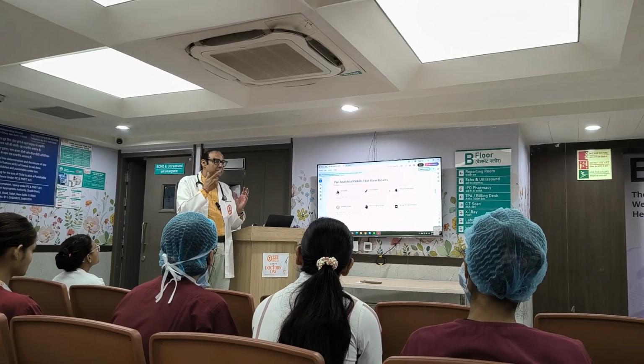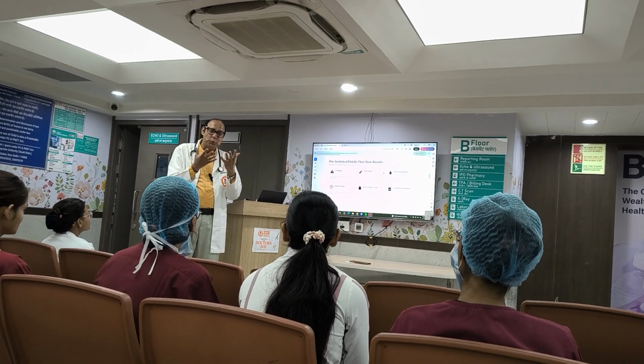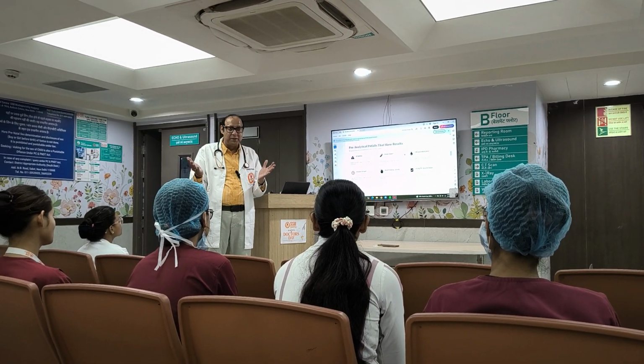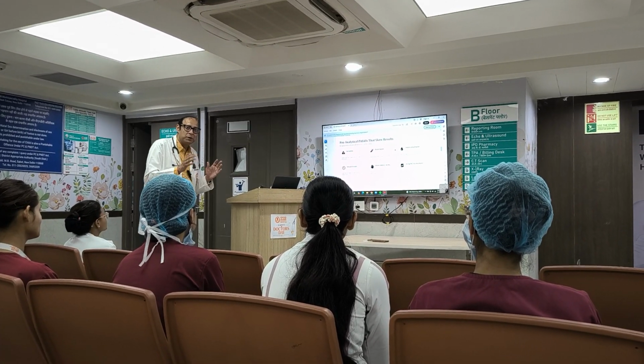क्या होता है कि if not in an ice pack, the cells of blood are going to break down. So जब टूटेगा ना, तो उसमें से LDH and जो और component है, तो मतलब your result will be affected. So try to be very quick, and cold transportation should be done in the proper way.